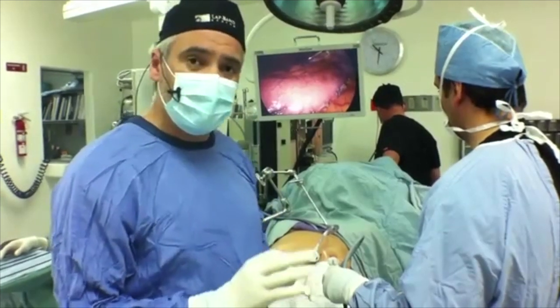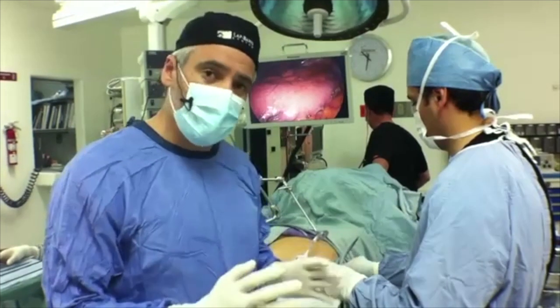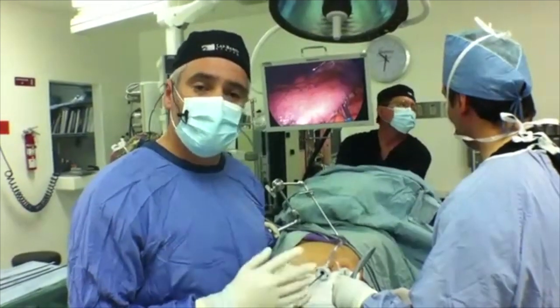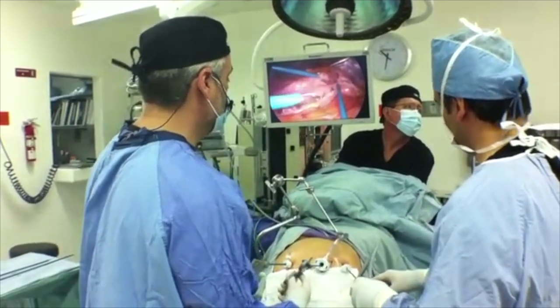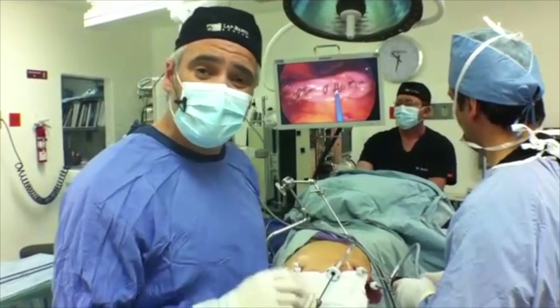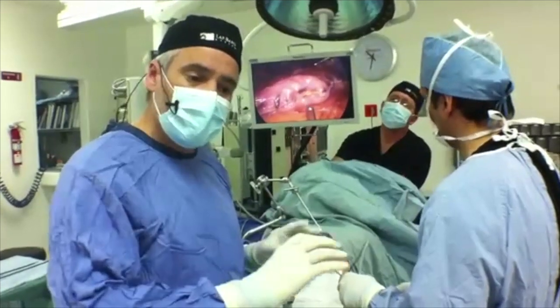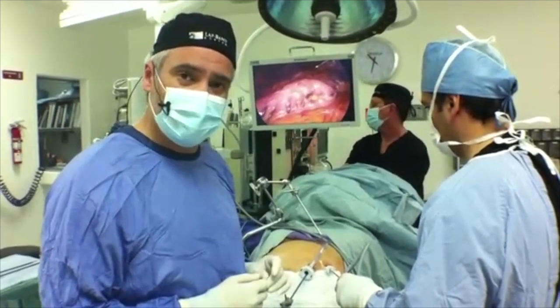The interesting thing is we all learned the technique in a very similar way. Our suturing technique is what permits us to be complication-free. There are reasons why we do two lines of sutures — it's very difficult to create the tubular stomach we want with just one line. The first line of sutures is going to be an independent line, meaning one stitch, one knot, placed far apart. The second line will be the one that actually contains the stomach, and it's a running suture.